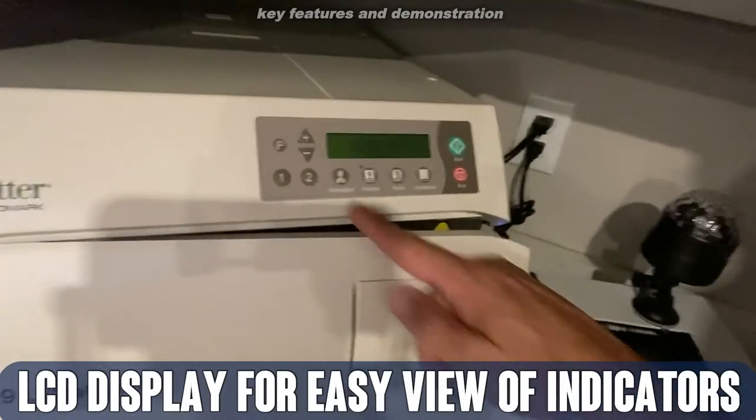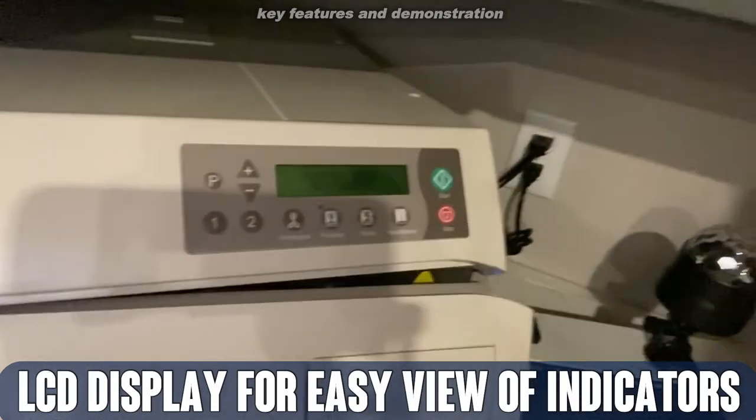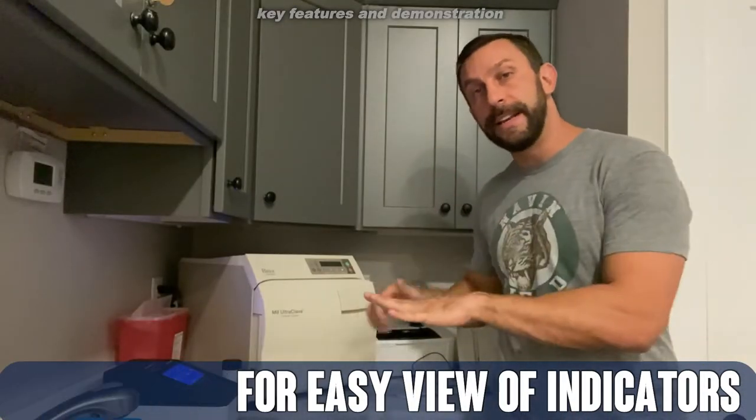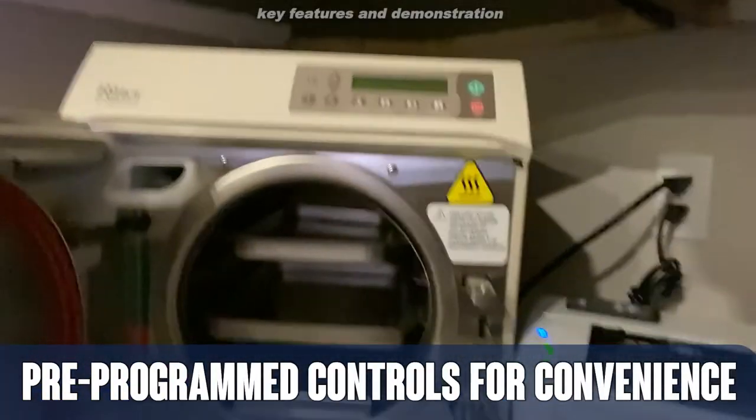You've got a black and white interface with all sorts of information — hand pieces, packs, pouches, and unwrapped. You can put your tools and equipment right in here, press the button, leave it, come back later, and everything is sterilized and ready to go.